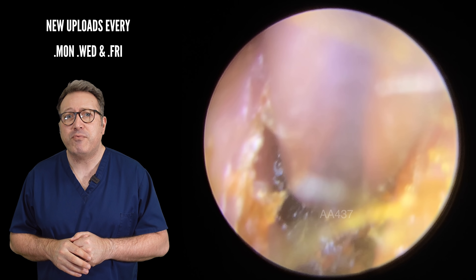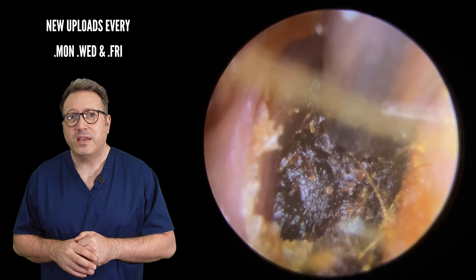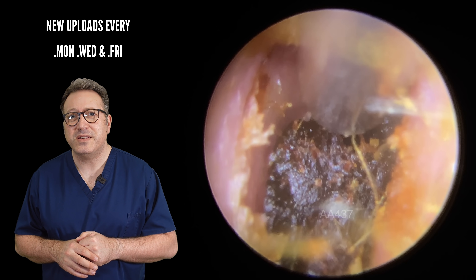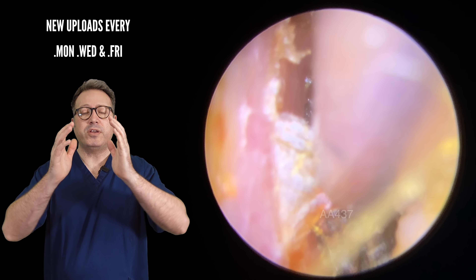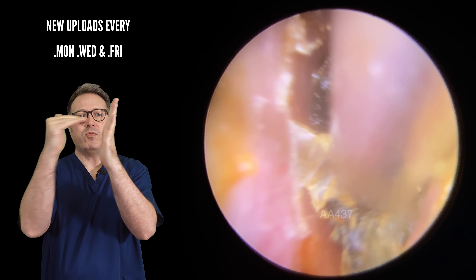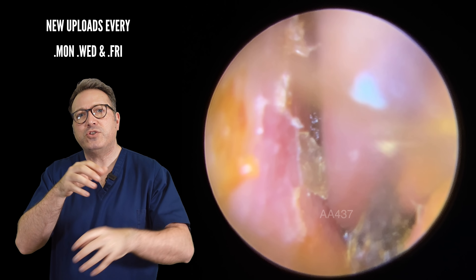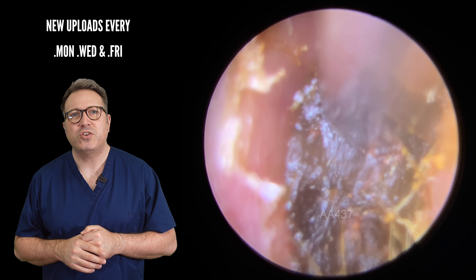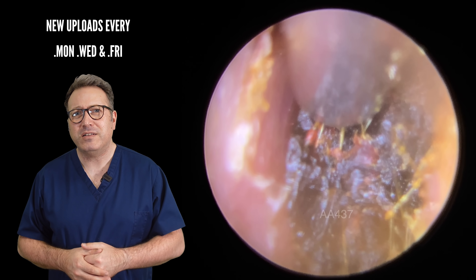We can see a little bit breaking away from the right side, back to the bottom again — still not budging. We're starting to see a little bit of the top of the eardrum, but the ear canal is almost kind of a V shape here. What's happened is the wax has leveled off and it's stuck all the way down and across the bottom as well. We're really trying to pull that section away, free this top one up and try to roll it — but it's just so firmly held in there.